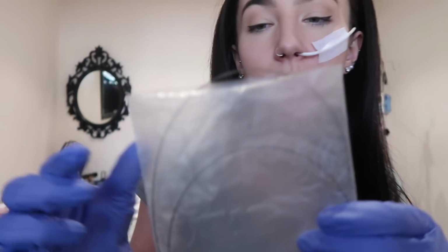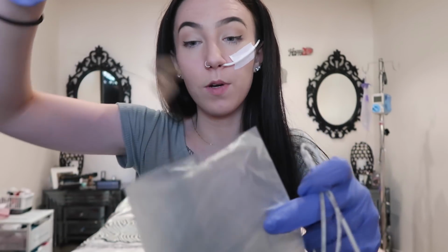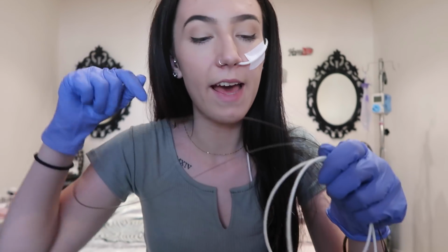So next we have our container and the guide wire, which is actually back in the bag that the tube came in originally. So what I'm going to do now is unwrap the tube, which has been in the tissue. It's just been drying off. I'm then going to take the guide wire, which again is pretty sterile because that's just the plastic that the tube comes with. And what I also didn't show you was I pumped a couple of syringes of air through the tube to get all the water out, because if you leave stagnant water sitting in there, it's not going to be very sterile. And this guide wire is going to push any remaining bits of water out anyway.